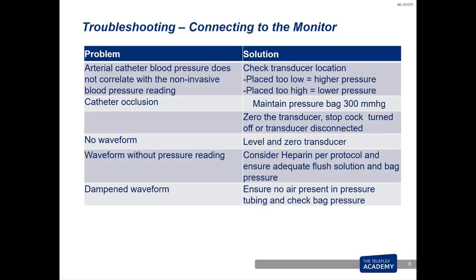If you choose to use a cuff and a blood pressure, and compare it with the blood pressure from the arterial catheter that's indwelling, you're doing a non-invasive versus an invasive measurement. So we really encourage you to pick one over the other. When you think about your blood pressures not matching and not correlating, one, it will be very infrequent when they will correlate. The other one is when you look to see if you're doing a sample of an arm blood pressure non-invasively or an arterial indwelling catheter blood pressure, and the numbers do not correlate together, you want to think of a couple different things.